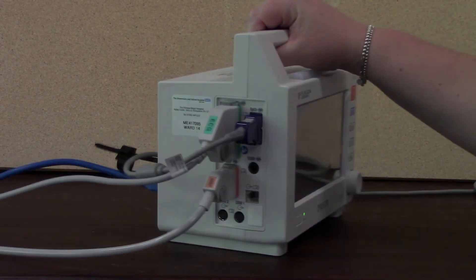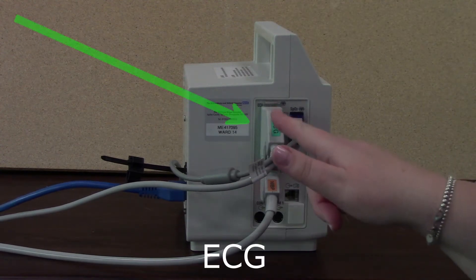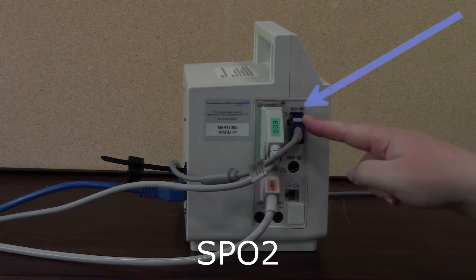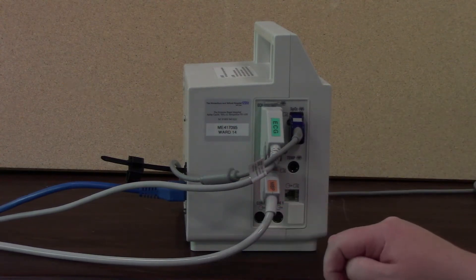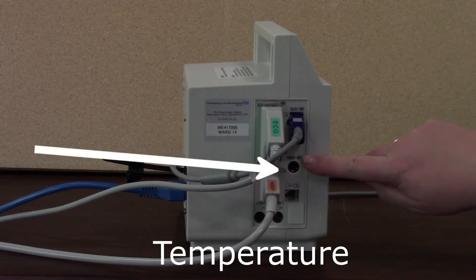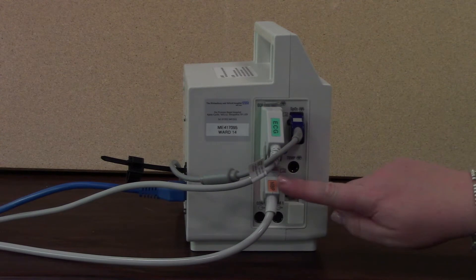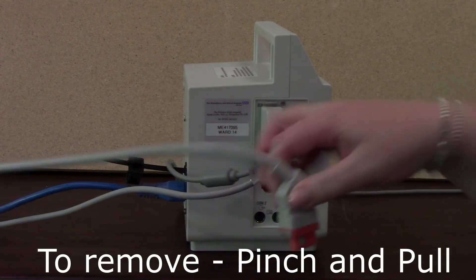If we just turn the monitor around so you can see the side area, you can see that we have the ECG, saturation probe, and non-invasive blood pressure cables all plugged in. Temperature goes in here, just at the front. To remove any of these cables, you just pinch and pull.